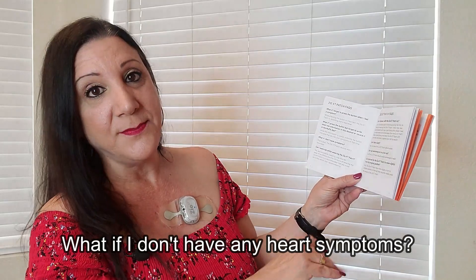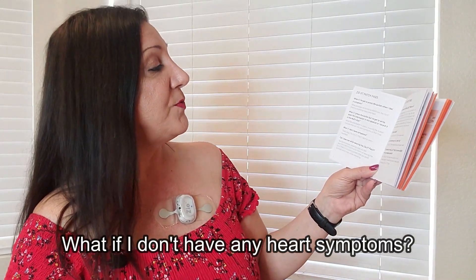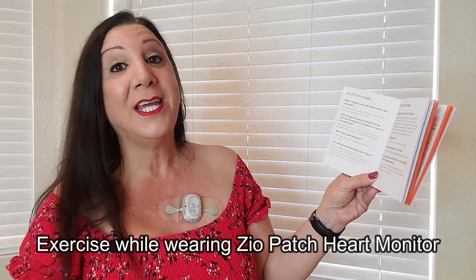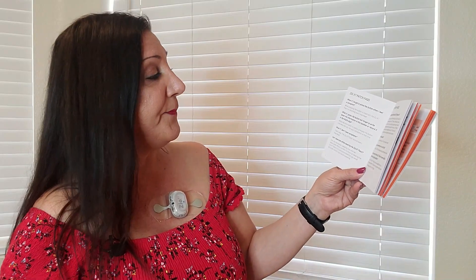What if you don't have any symptoms? That's okay — the Zio patch records every heartbeat. Can you exercise while wearing the Zio XT patch? Yes, but excessive sweating may shorten wear time. Within the first 24 hours of wearing the patch, it is recommended that you avoid activities that can cause sweating.